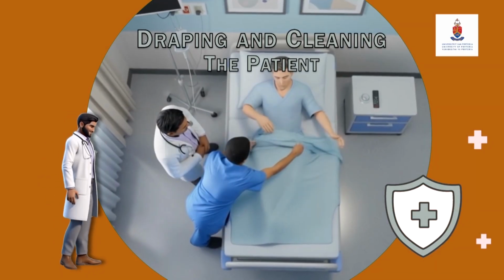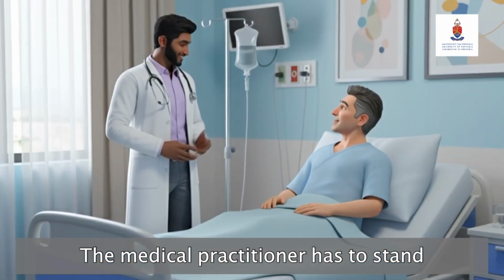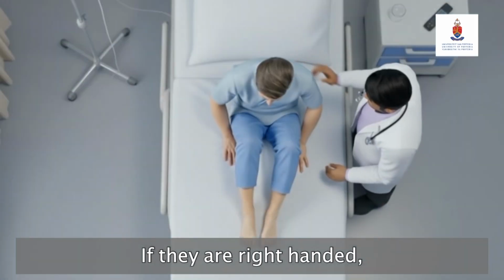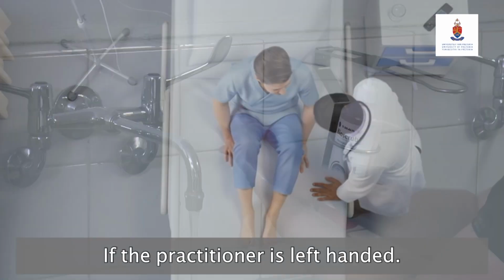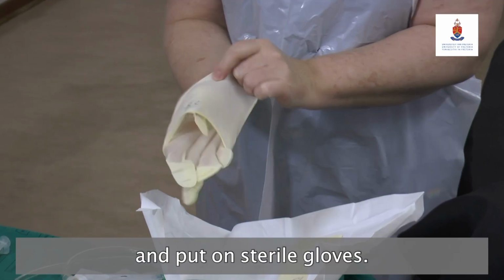Draping and cleaning the patient. The medical practitioner has to stand next to the right hip of the patient if they are right-handed, or on the patient's left side if the practitioner is left-handed. Wash your hands aseptically and put on sterile gloves.